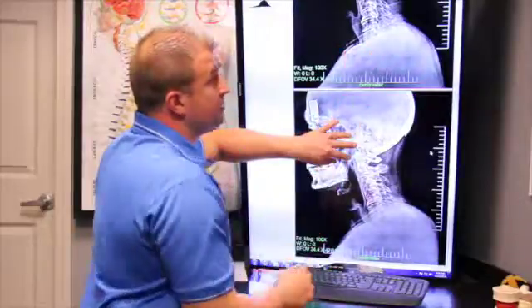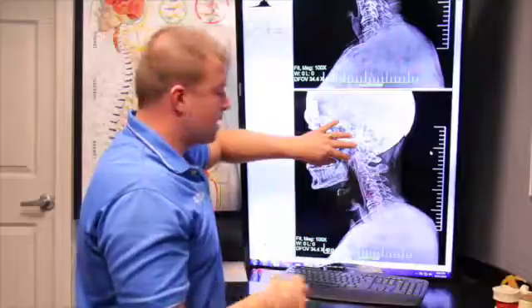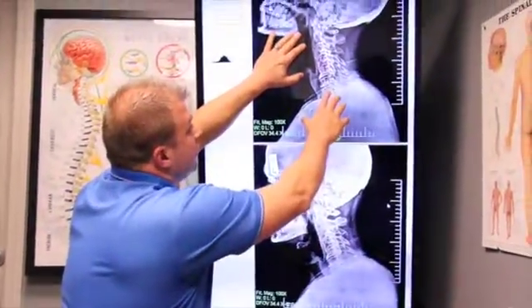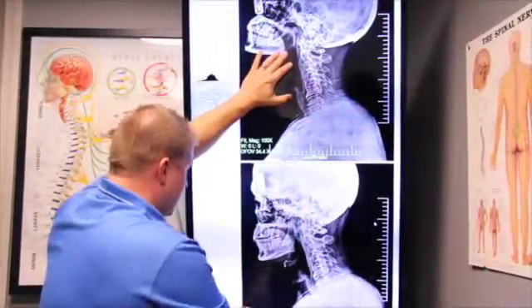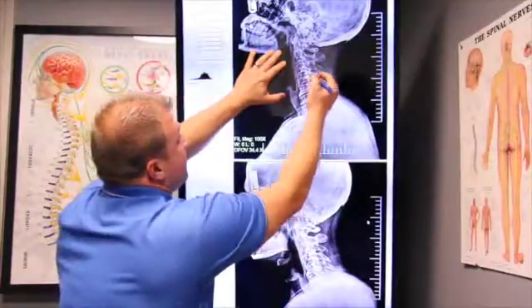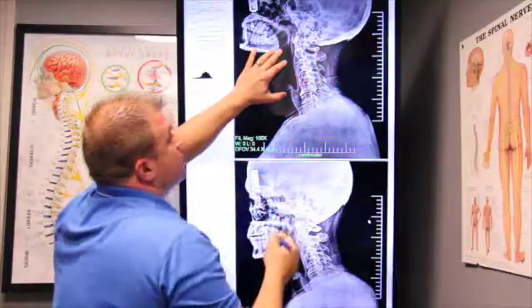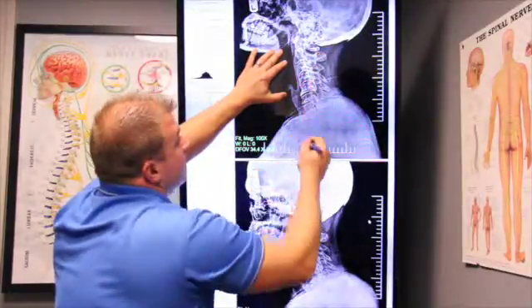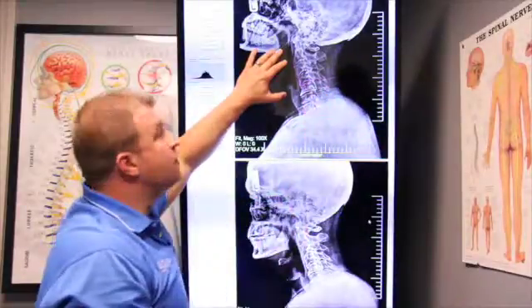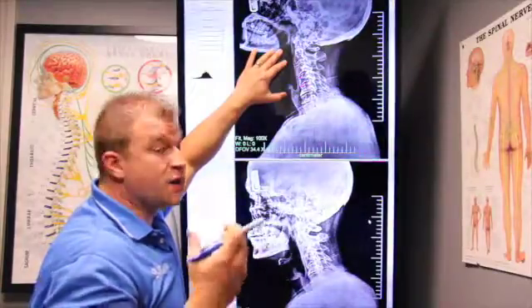And when we go up to this picture where he's looking upwards, we can see how the integrity of that spine has moved. When I take the same transparency and put it down here covering the first bone, the first bone that's actually moving in this guy's spine is this bone, and this bone are the only two bones that actually move backwards in his spine. So this bone, this bone, this bone, none of those moved, and those are putting pressure and stress and strain on his nerves as we know it.